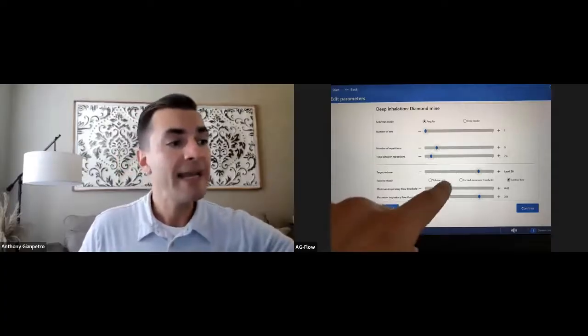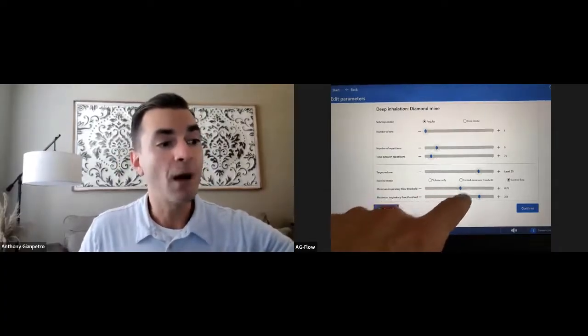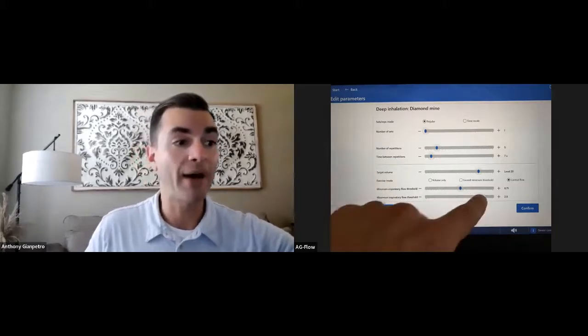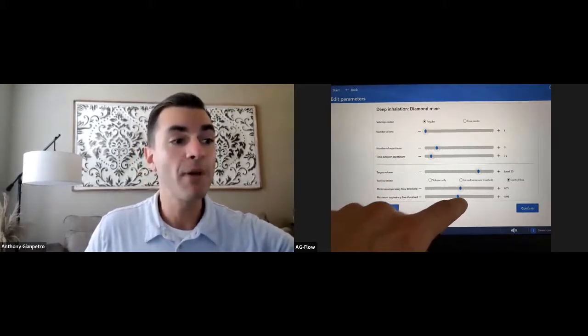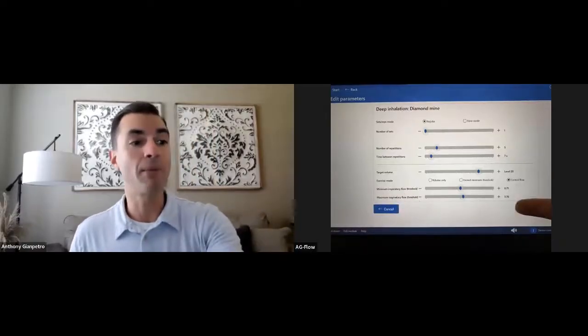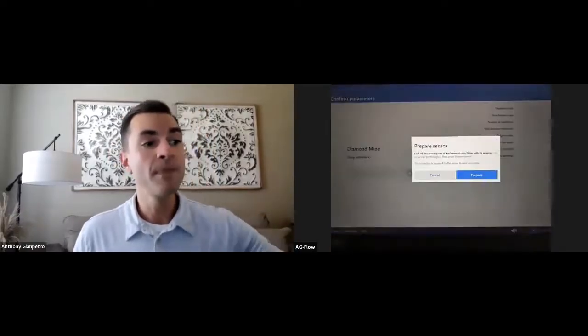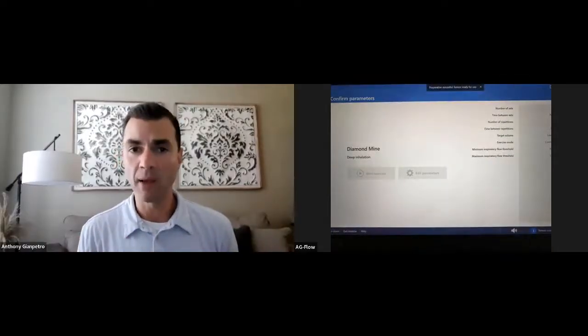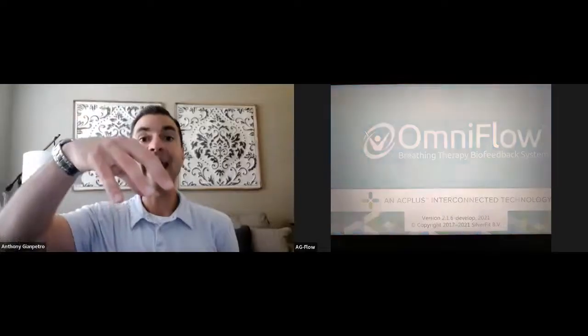So what I'm going to do is keep my minimal inspiratory threshold, the first one that I showed you, the stalactite, if you will, at about halfway. And I'm going to do the same for that stalagmite on the bottom. Okay. And you're going to notice that as I hit start and I prepare my sensor, again, I'm educating my patient. I'm explaining to them what to expect, making sure everything's all set. And I have my collection tools if needed. They're going to see the stalactite develop from the top and the bottom. And that prevents them from going to the bottom with too powerful a breath.